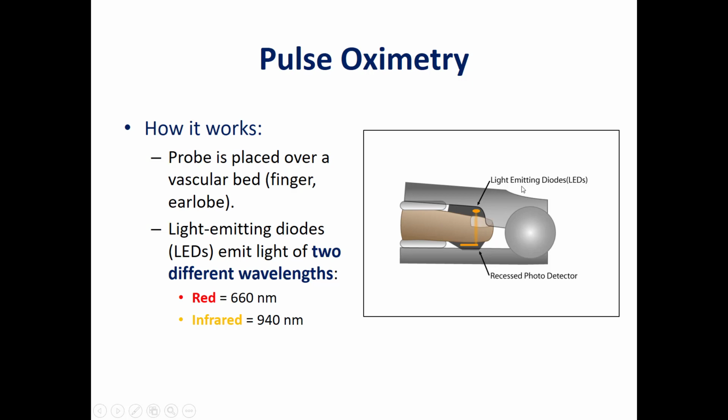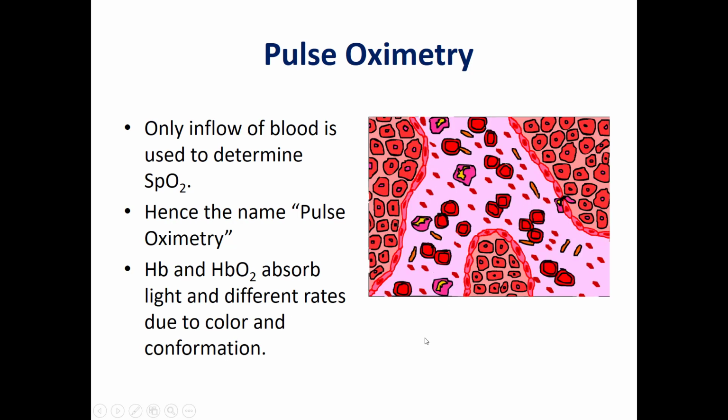It can be used here. As we also saw in the first part, we can use this pulse oximeter sensor on the finger, the earlobe, or other sites like the forehead. But this type is used on the finger. We will have a model for this type, the transmitted type used on the finger.